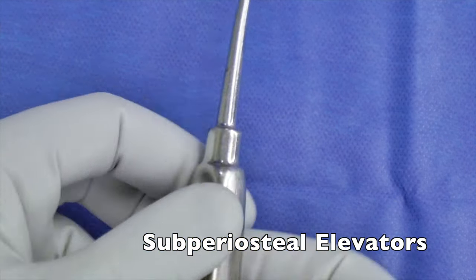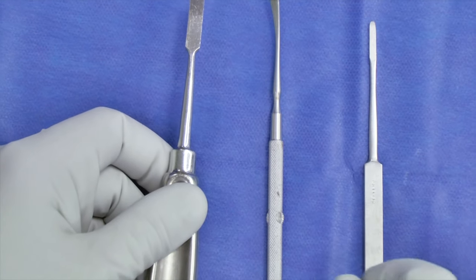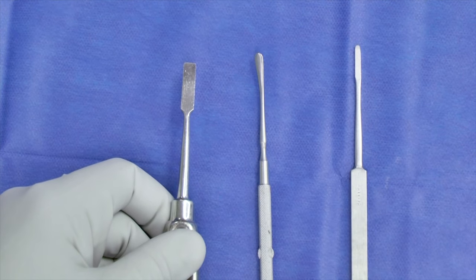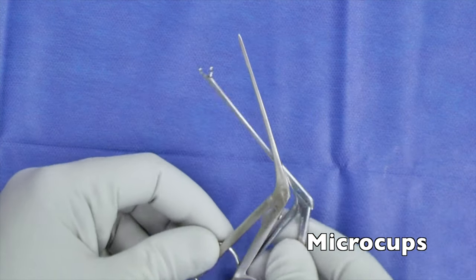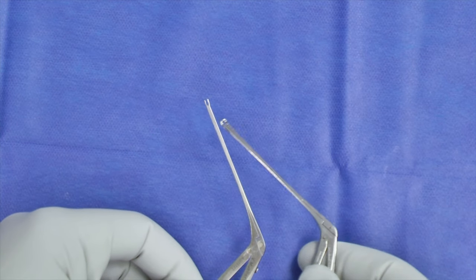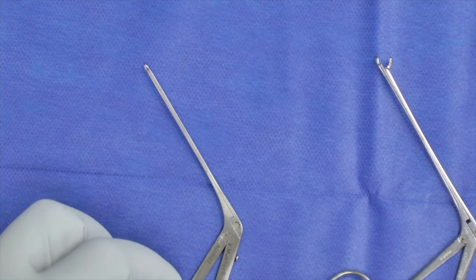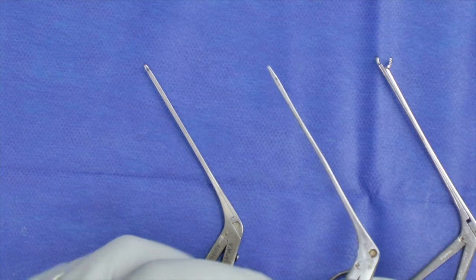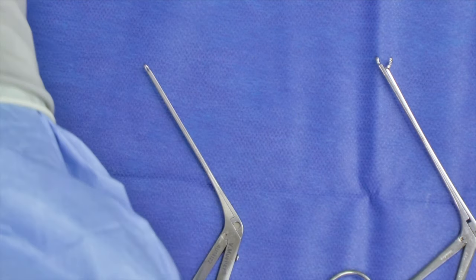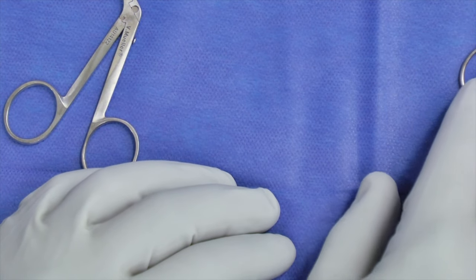Then we have our different assortment of subperiosteal elevators or Lempert elevators that can be used when you're raising your musculoperiosteum and ear canal skin when you're going posterior to the transmeatal. These are your different micro-cups — this is a little bit larger cup, and this is a more delicate micro-cup. You'll use those most commonly in the middle ear, but also for tumor work. I tend to use cups a lot more than alligators — I feel that they grasp things quite a bit better. You'll also have left-going and right-going micro-cups, which is very helpful for cholesteatoma work in particular.